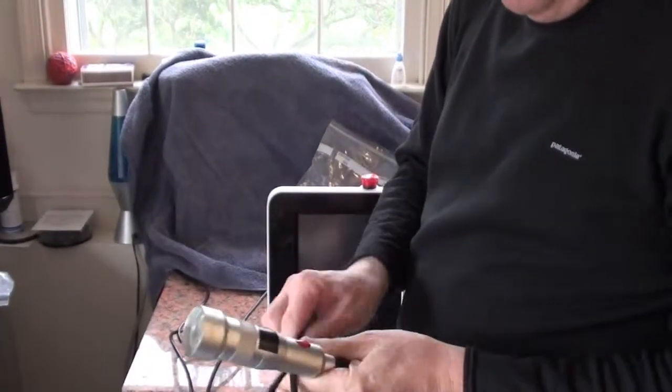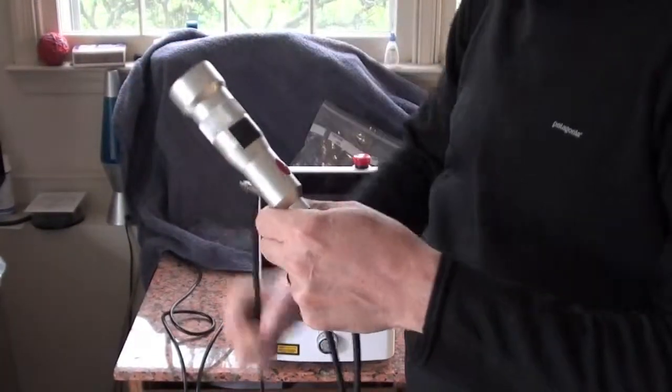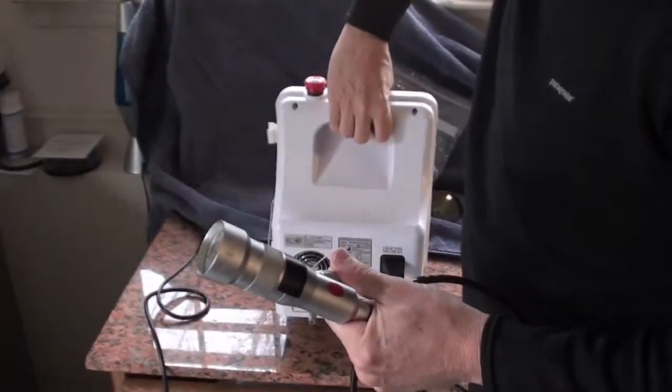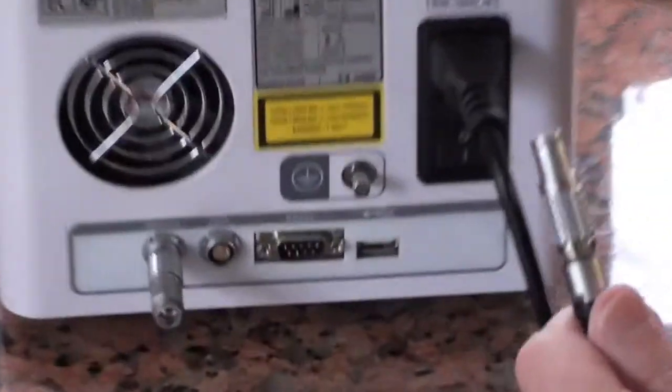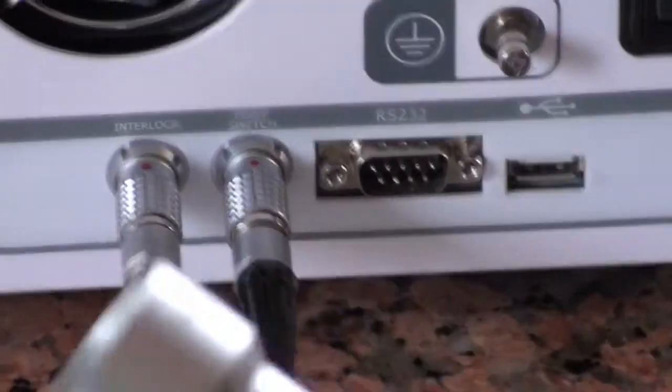And I'm going to demonstrate a few things on this. So you unhook it here. And here's where the foot switch goes in. It's the same thing. You turn it around, 12 o'clock high. It should be very easy to go in. See how that came in. Flip it back.